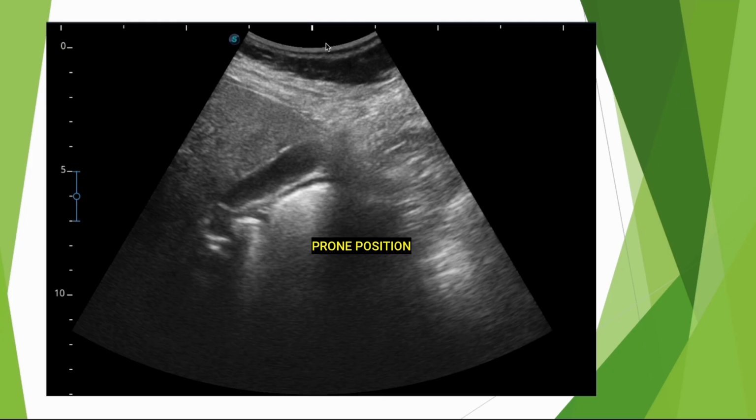So actually, the bottom of the image is here. And of course, as always, you have the head and the feet. But this time, the exam table is here since your patient is lying on their stomach. So the gallstone we saw earlier should have moved. The gas will also shift since it can move around. You're basically going to press on your patient's stomach by turning them onto their stomach. And the gas will move and your image will change. That's exactly what's happening here.